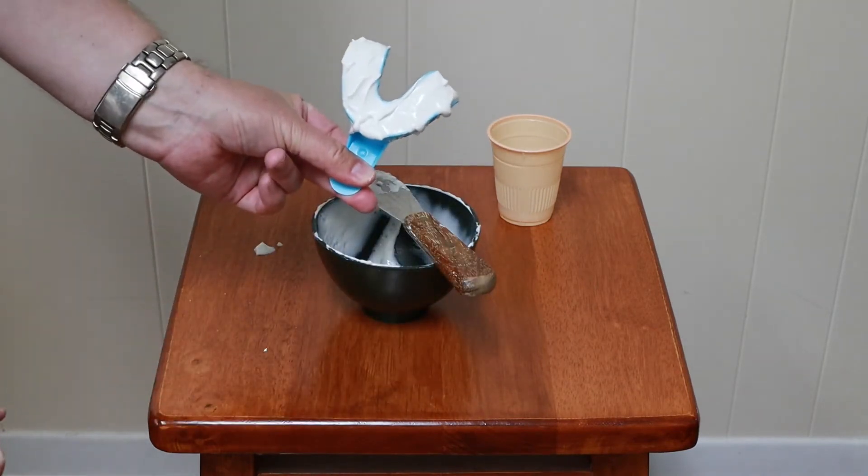Okay, so there it is, and now let's take the impression. Okay, so the material, once I insert it, it's going to take about a minute and a half to two minutes to set up, so here we go.